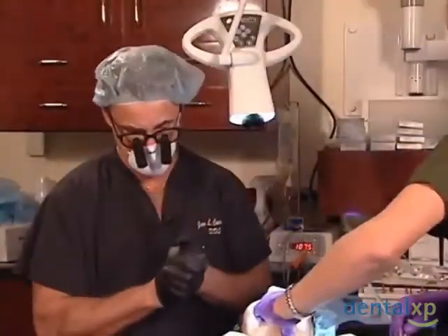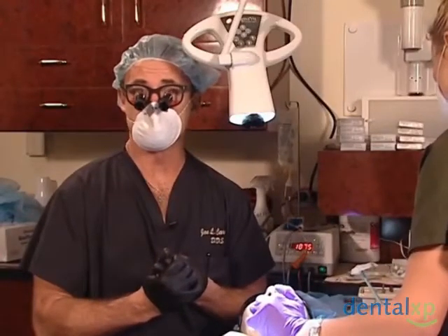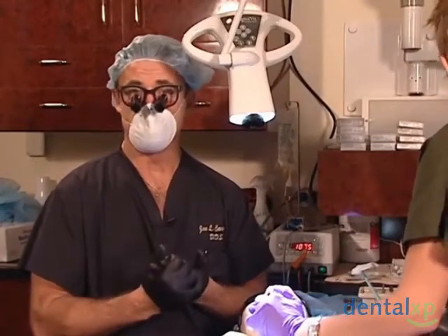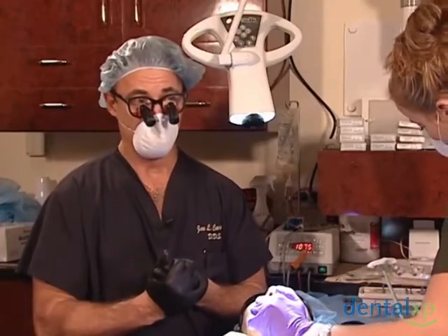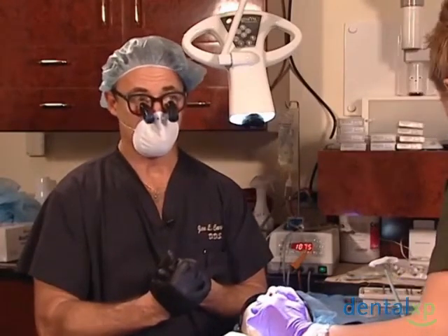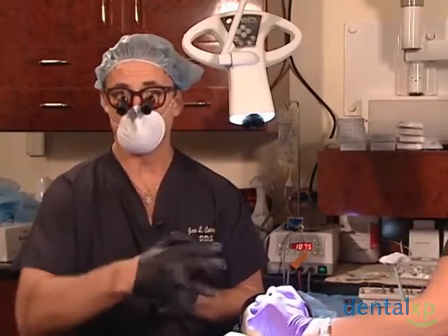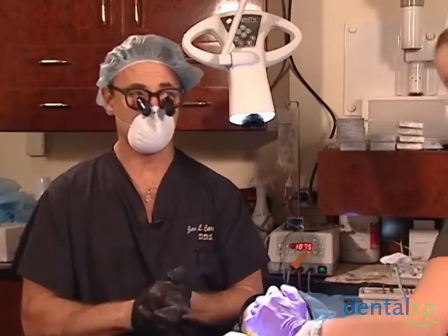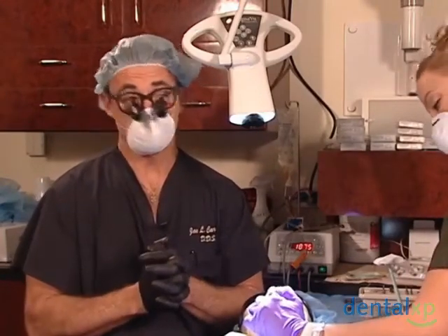So now we're comfortable with what we've got. We're to depth. We've gone in 2 areas with the 1.6 burr to 15 millimeters, and the other 3 areas we've gone to depth with a 2.4 millimeter burr to our 15 millimeter depth. Now we'll place our implant, or attempt to place our implant. If I can get it within 2 millimeters, then I know I'm good to go, but I won't completely seat it. I'm going to put all the implants in place, because a lot of times you can actually expand the bone, more so in the upper, but sometimes in the lower if you sequentially put them in.